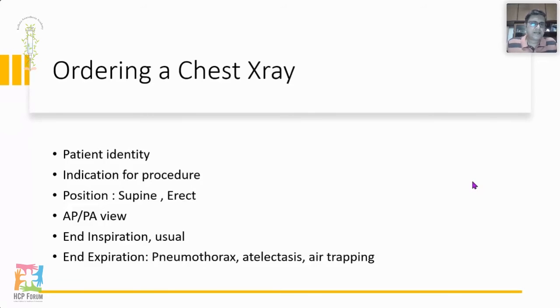The other thing is anterior posterior view or posterior anterior view. If anything is not specified, then the x-ray should be a posterior anterior view. That means the x-ray beam would be coming from the posterior aspect and going towards the anterior aspect, and the x-ray film, nowadays there is no film, just a digital receptor, just like our cameras, lies anterior to the chest. There is a gap between the x-ray generator and the person. The film, let's call it the film, is kept flush with the patient's chest and the patient stands erect.